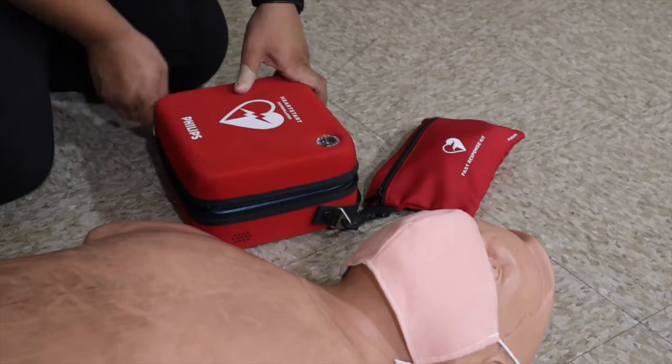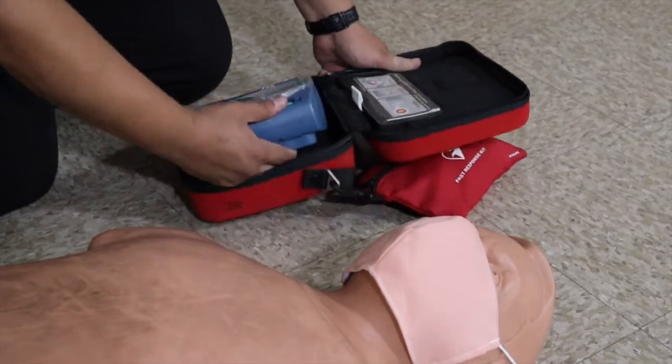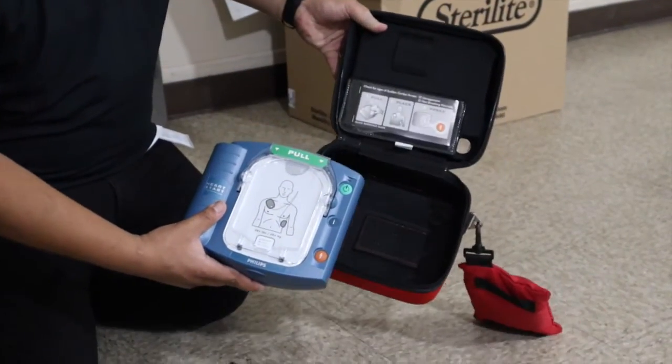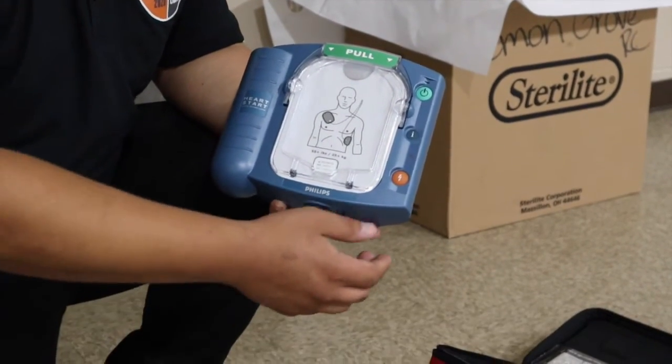Alright, so first you're going to open up the defibrillator. This is the actual defibrillator and you're going to look for instructions right here in the front. So the next thing you're going to do is turn on the defibrillator and listen for instructions.